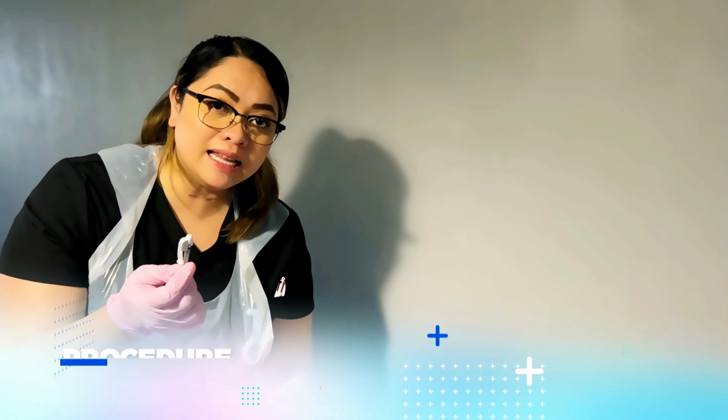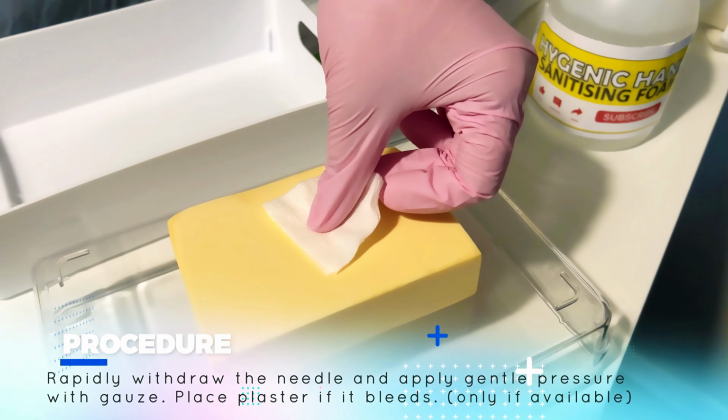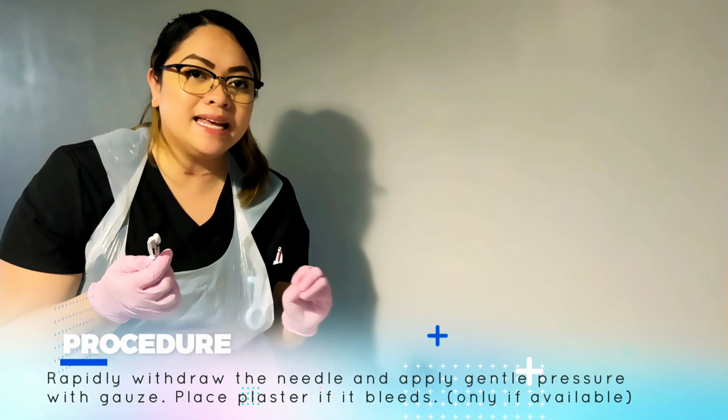So I rapidly remove the needle. Gently apply pressure on the site, okay? So at this time, I'm going to use a gauze. Don't worry, normally if we are giving insulin, there's no bleeding, okay?